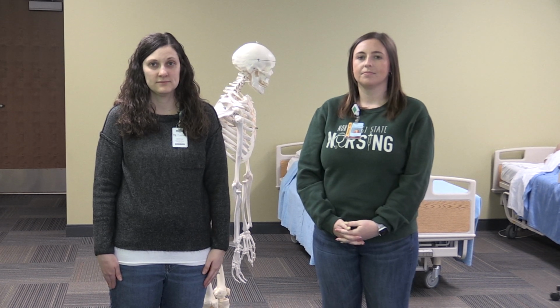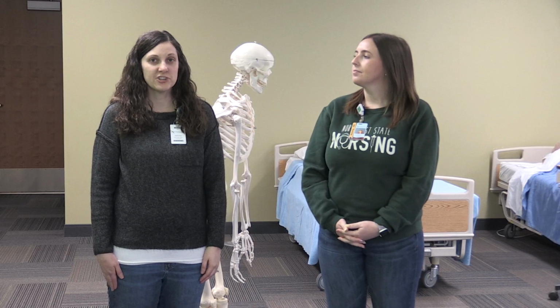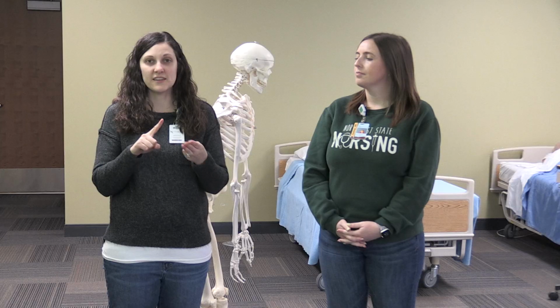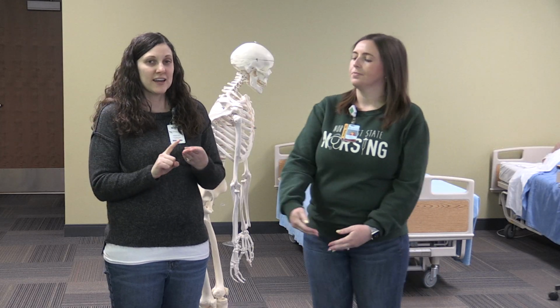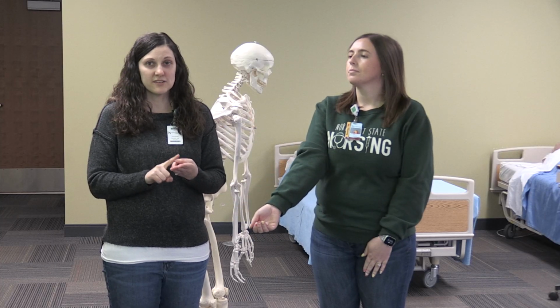Today we will be demonstrating injection sites. There are 3 different categories for injection sites. We have the intradermal, the subcutaneous, and the intramuscular. We're going to start with the intradermal category. And I will say for all these injection sites, you will need to know the landmarks of all these for your checkoff.